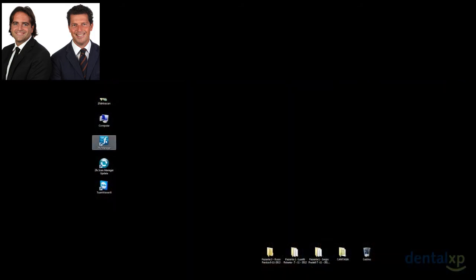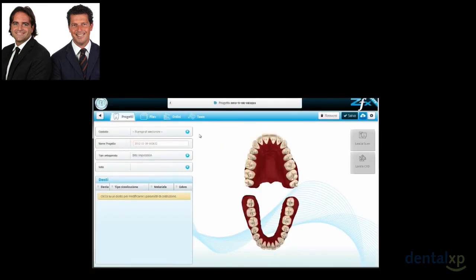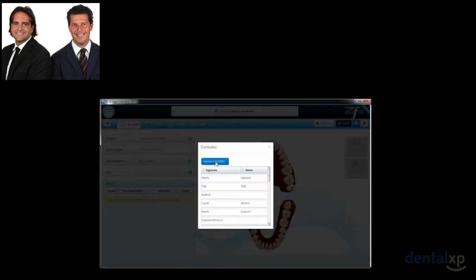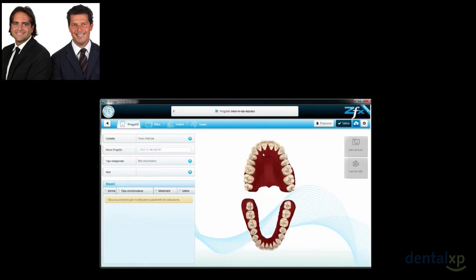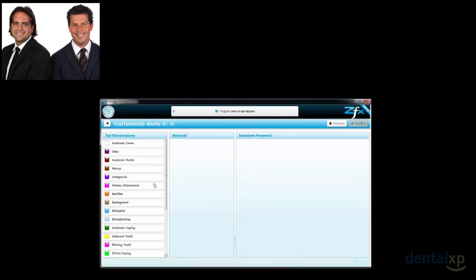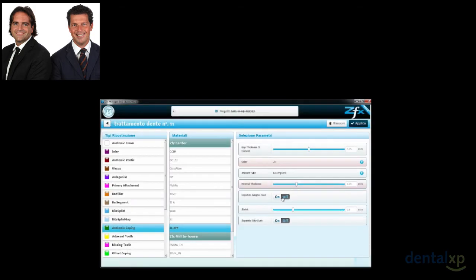So let's see this video where we have literally all the digital workflow of the digital impression day. What I'm doing now is just doing the prescription for the lab. The only difference from the traditional procedure is that I'm doing it on the computer and not on paper. Then I save it, and then I begin to choose all my parameters. I choose number 8, and I want an anatomic coping in this case, so I click on it, I choose the material that I want, and I choose also the shade, for example.